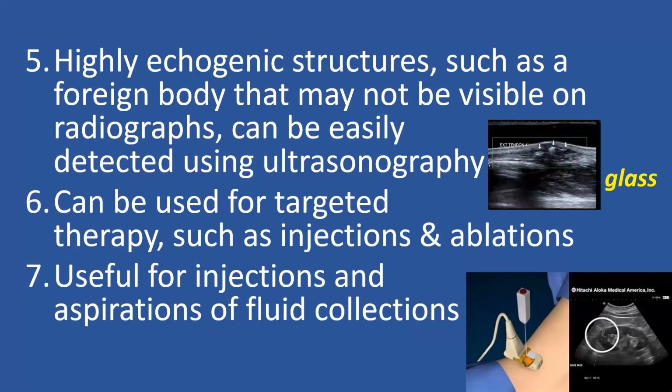It detects highly echogenic structures, such as a foreign body. Let us speak about glass. If you have glass in, you cannot identify it by a plain radiograph. Being that it detects highly echogenic structures, you can use it to remove that loose body, that particle.